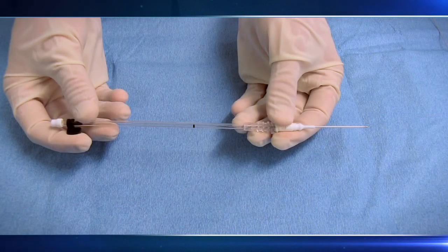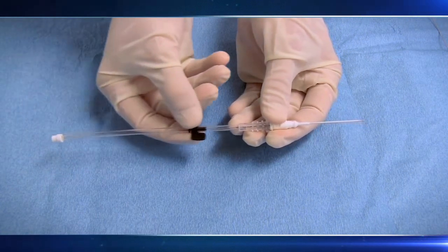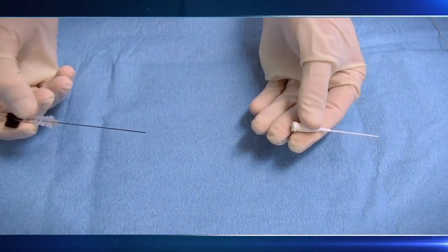And finally, the third option is a combination of the two called a modified Seldinger technique. This involves threading a built-in wire through the needle and then threading the catheter off the needle and wire.